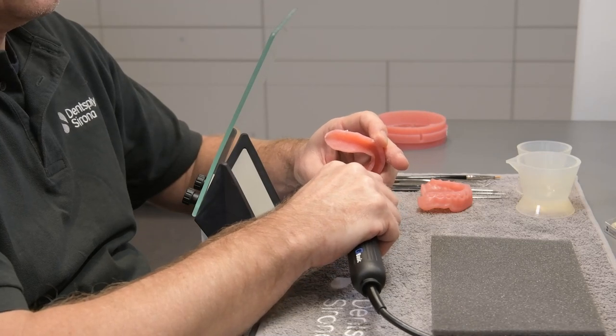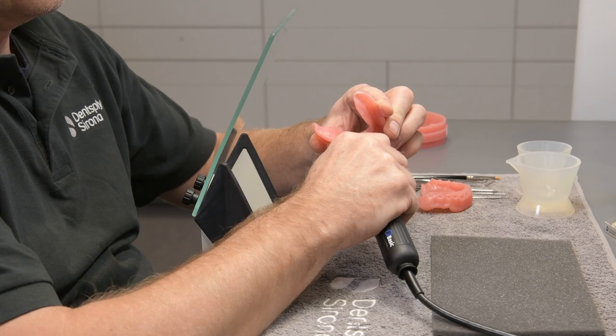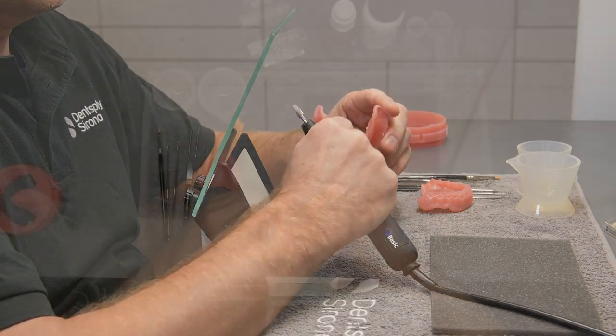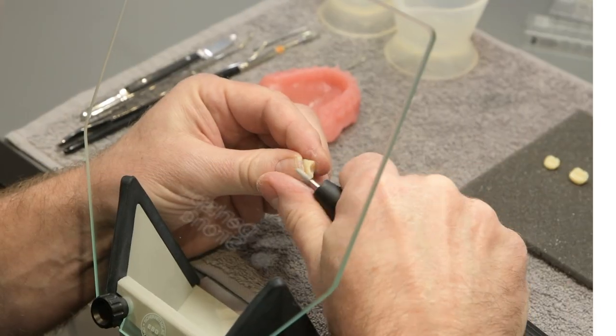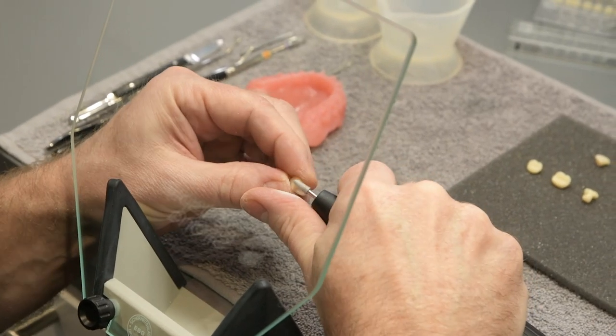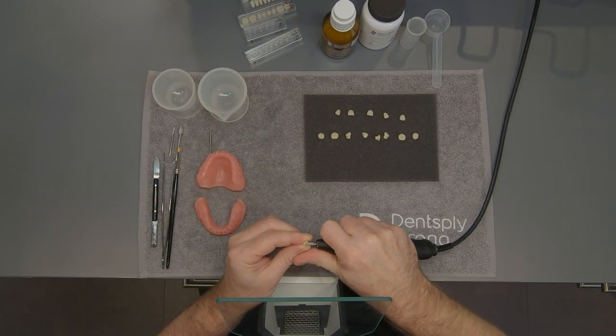Carefully remove the sprues and then blow all the shavings off with compressed air. If needed, remove redundant material such as in the proximal area, basal corners, or edges with a fine burr.